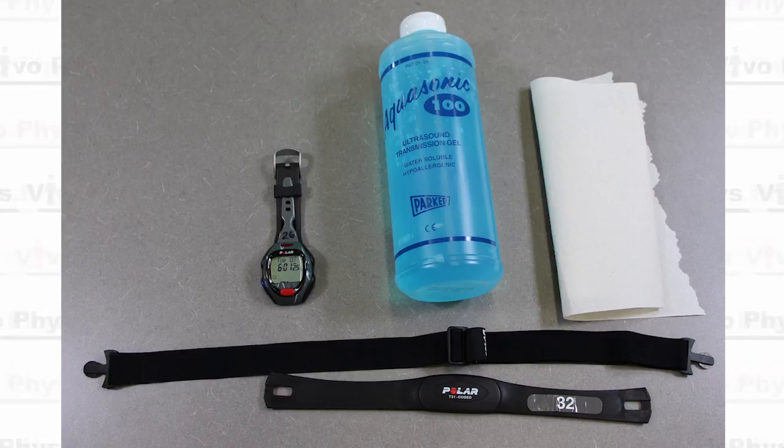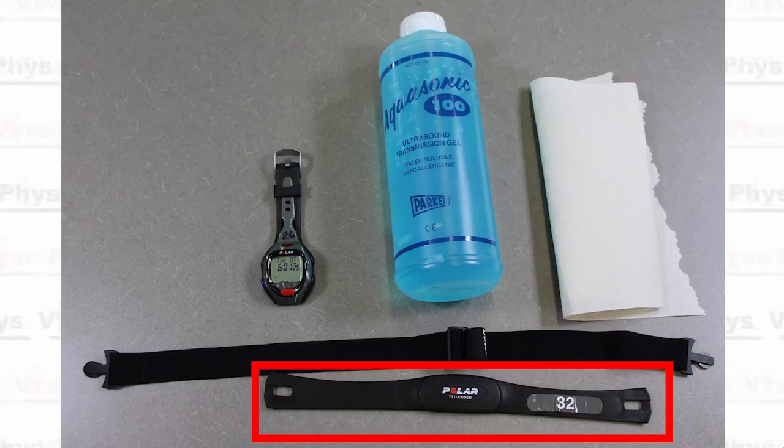We're going to be using a Polar T31 type heart rate monitor. The other chest strap type monitors are going to work very similar to this. So what you're going to do is take the heart rate monitor — the hard part of the strap. The strap is two parts: a hard part and an elastic adjustable part.